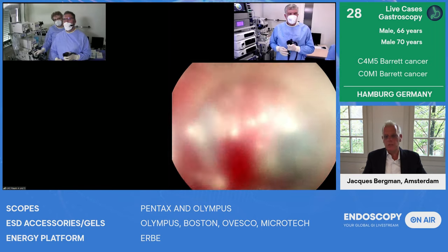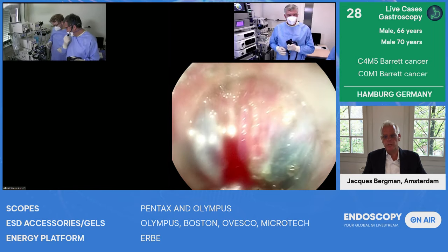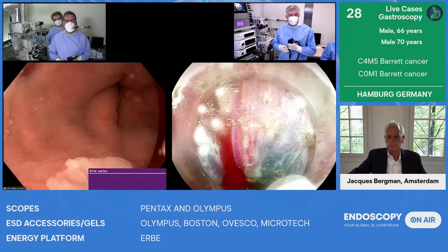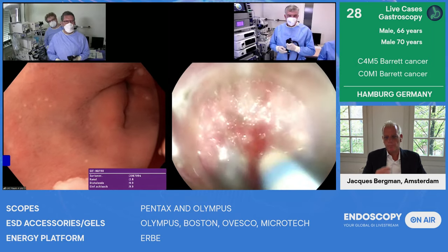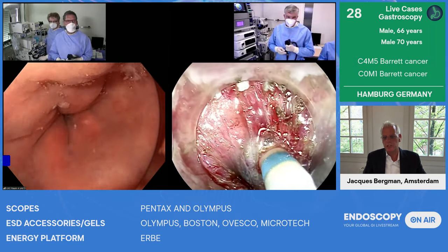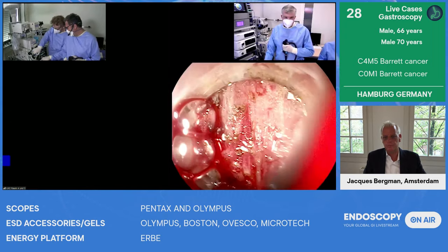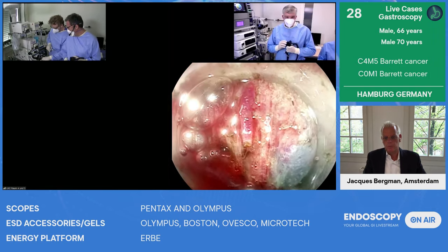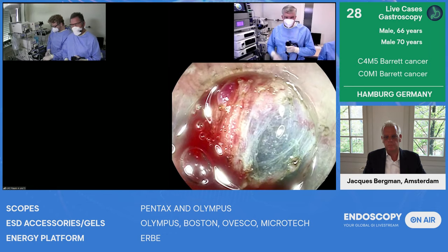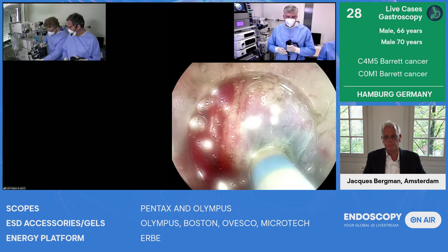Thomas, do you always need to have the needle out if you're already in the submucosal space, or can you also inject without the needle? You're right. Very good point. Most bleeding comes from the needle out. Can you show that you can inject with that? Oh, sorry, that's not the injection needle. No. That's right. The ablation tool. And also you are in different levels when you do that. You know, yeah. So on the right side there's submucosa. When you see that, you know that the left side is not deep enough.